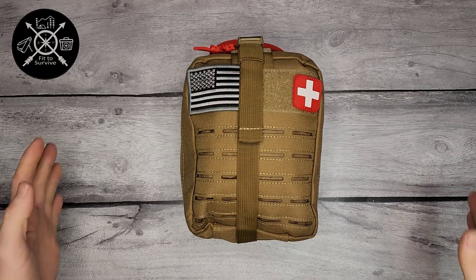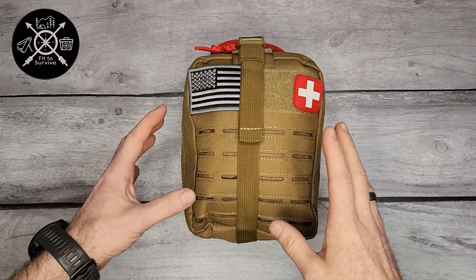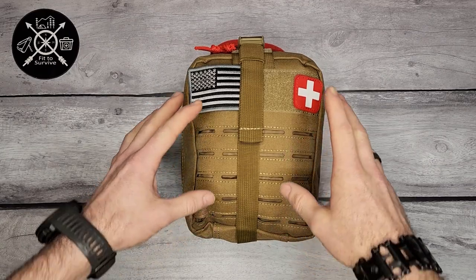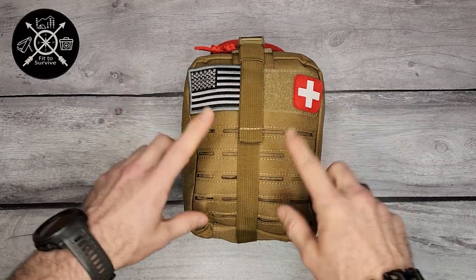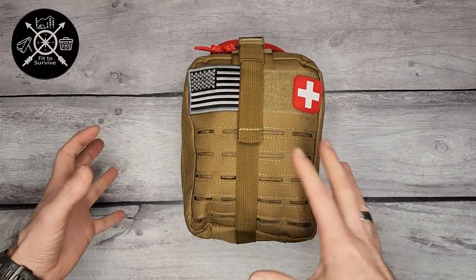Hey, welcome back to the Fit to Survive channel. What we have here today is a trauma kit from Everlit Survival. This is a ready-made trauma kit from them — I did not pack this — but we're going to go through and tell you a bit about it, show you what's inside, and then we'll go from there.